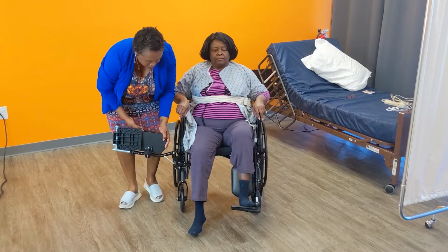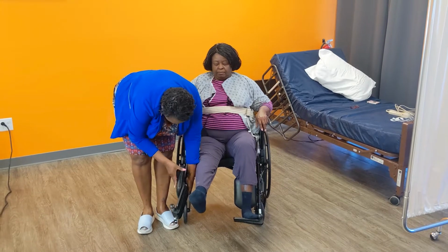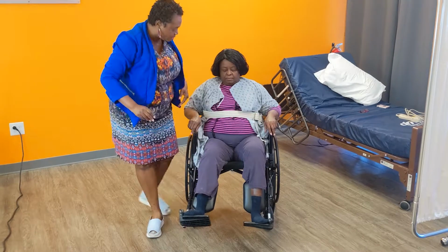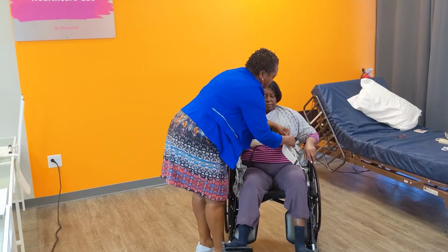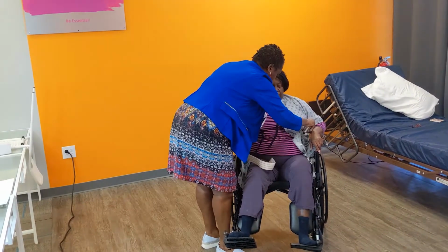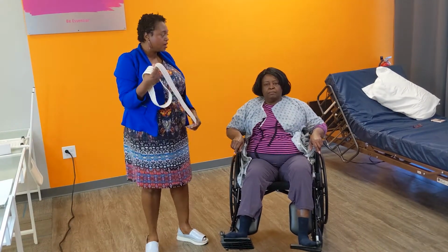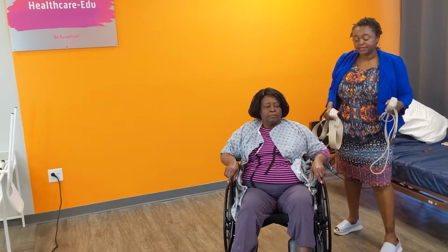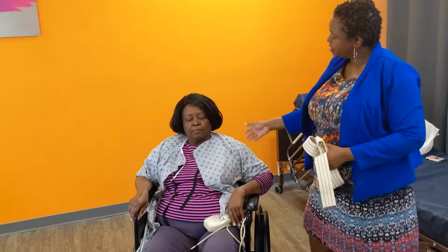Oops. Can you lift up, please? Let me help you. Ooh. So I'm gonna drop this. There we go. Okay. There we go. And the last thing, I'm gonna take off my gait belt. You're all set. Let me just take off the gait belt here. If I wanted to put a bath blanket to cover her, and you always end up with your finishing up steps. So no matter where a patient is, they need to be able to call you. So here's your call light. Are you comfortable? Yes.